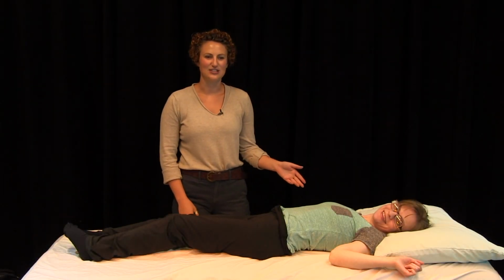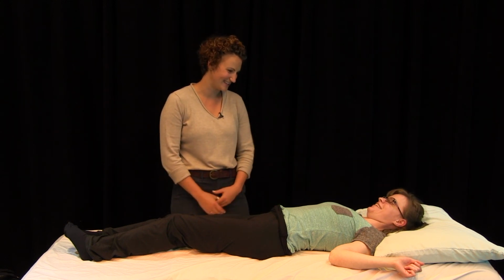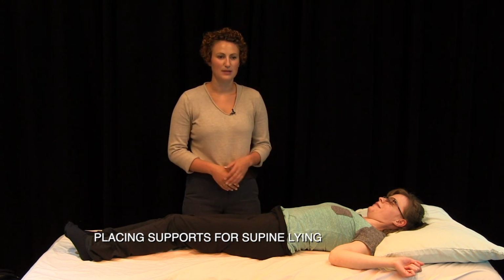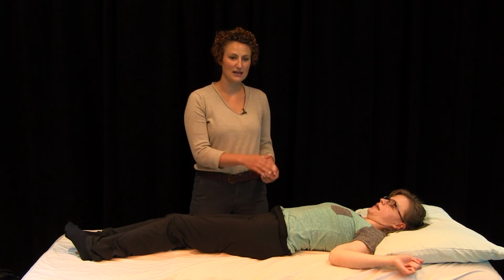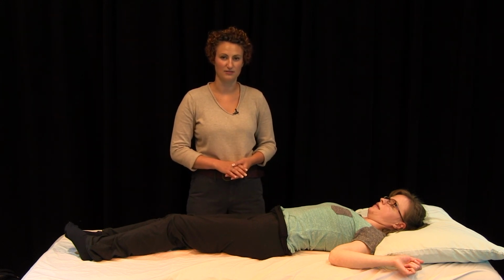This is Abby, and she is a user of 24/7 posture management and is graciously helping us with this demonstration. So we will start with the user lying on their back as much as possible. Begin noticing what happens with the limbs, torso, head, and feet. Identify the body's midline and notice where postural deviations and asymmetries may be occurring.